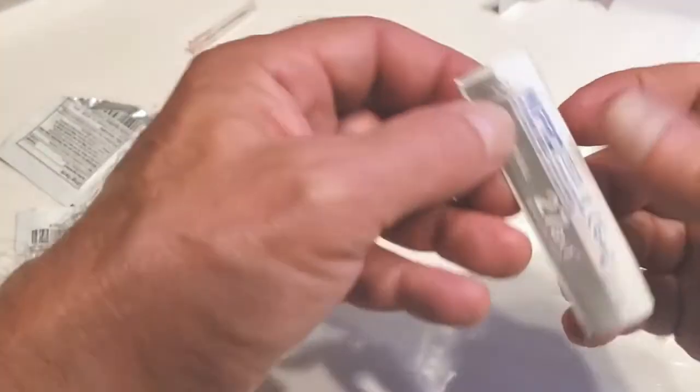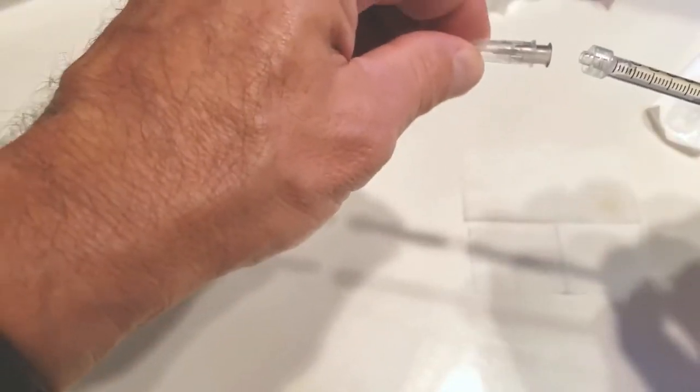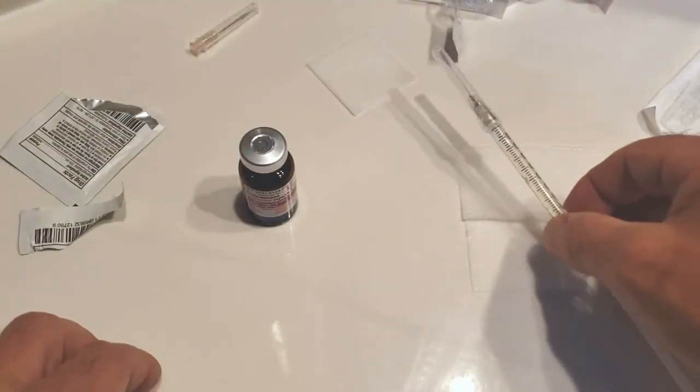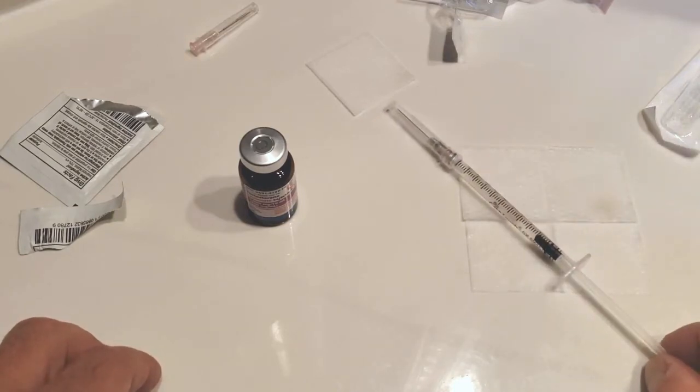Open up a 27-gauge, half-inch needle, which is very small and almost painless through the skin. Again, sterile hub into sterile luer lock, not touching anything. Secured. I now have a syringe preloaded with the proper amount of medicine.